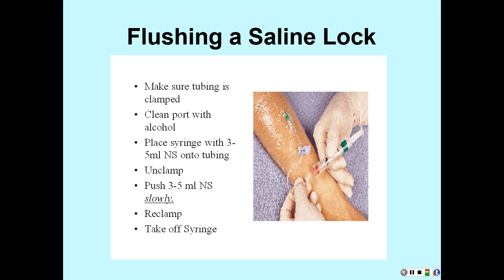Sometimes you'll go in there and you'll have 2 IV push meds. So you're going to flush before to make sure it's patent. Hook up your med, give your med, flush it, then give your next med, and then you flush it and clamp it off. You can connect an IV drip to this and infuse a piggyback, or if it's a push medication, you can push through this. Okay.